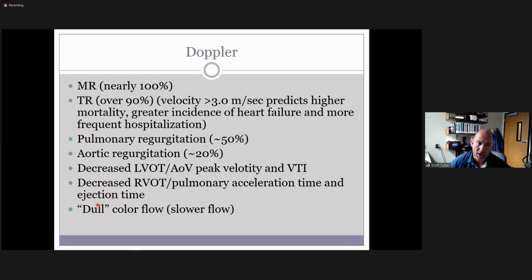As a student, often we get the pictures that are sort of acceptable. It's like when I showed that M mode at the beginning that wasn't quite in the middle of the chamber. Some things you can't correct by manipulating it after the fact on the PACS. So it's really important that you understand that you've got the best information.